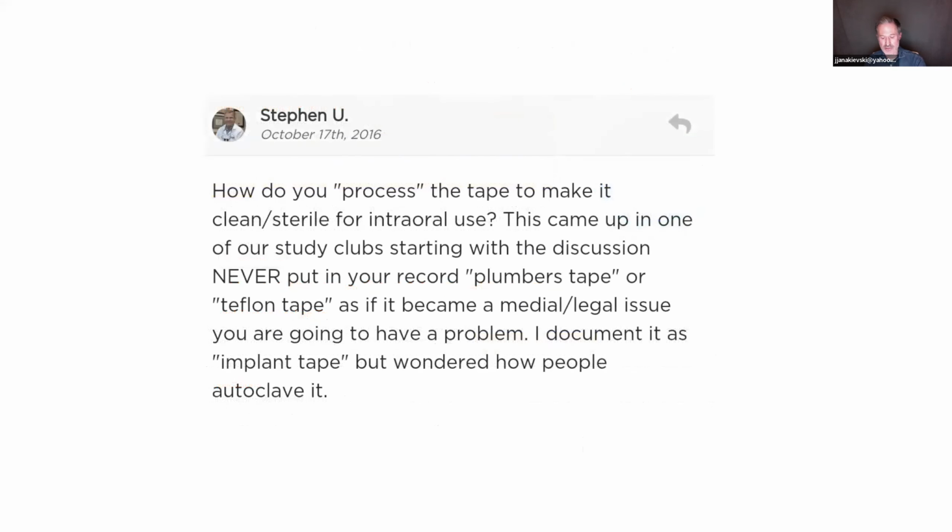And do we as clinicians, or does dentistry in general, have a concern about these products? This was our other question that we delved into when we were developing this. We said, does anybody else wonder about using this industrial thread tape in our patients? You can see this is from a large continuing education center, from their blog.